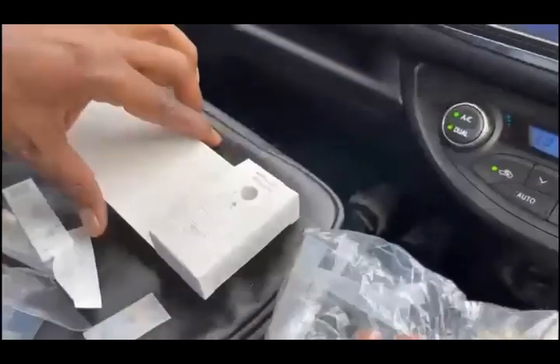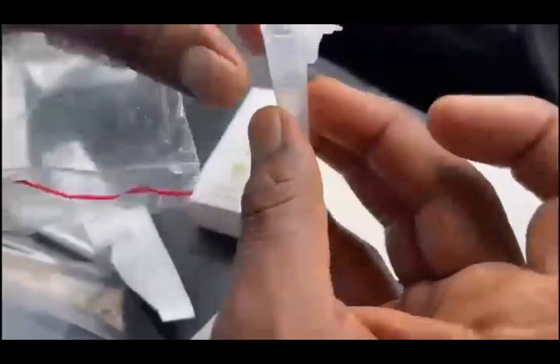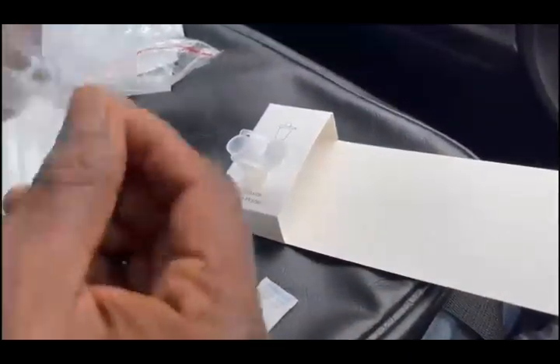Just put it here. Then put the water here. Then pour with the liquid.